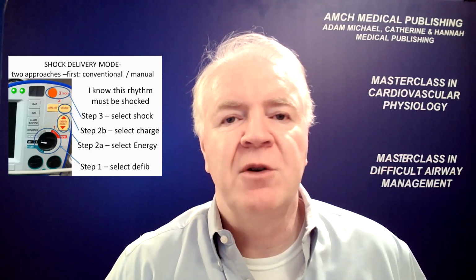Down arrows appear directly above the point in the PQRST complex, exactly where the shock will be delivered, which is within the QRS and avoiding the upstroke and peak of the T wave. Select energy level, such as 100 joules. Press charge to 100 joules and this will take a few seconds. Press and hold the shock key.